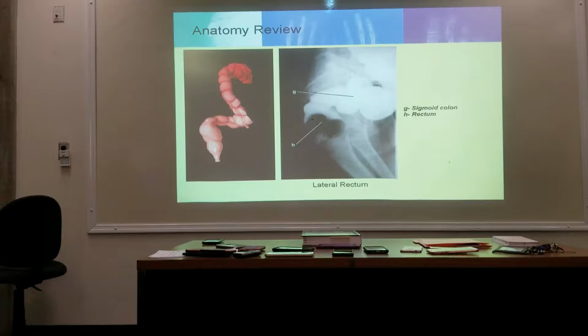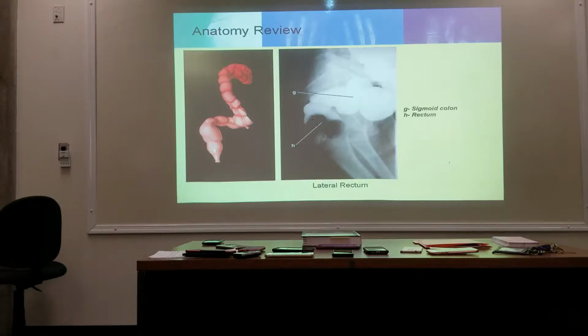It's the retention balloon on the enema tip, holding the enema in place. So that's the balloon. What's the maximum diameter that balloon can expand?